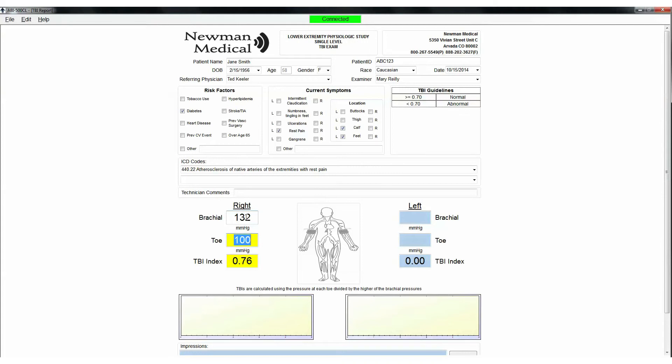To obtain a PVR waveform, press the button with the waveform image on it on the remote. The cuff will inflate to the proper pressure and hold that while the waveform is obtained. Press Next to move to the left brachial field. Repeat the previous steps for the left side to obtain pressures and waveforms.